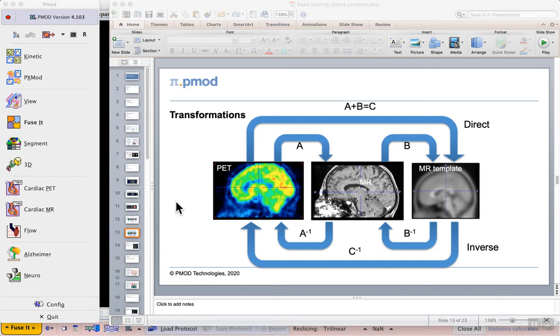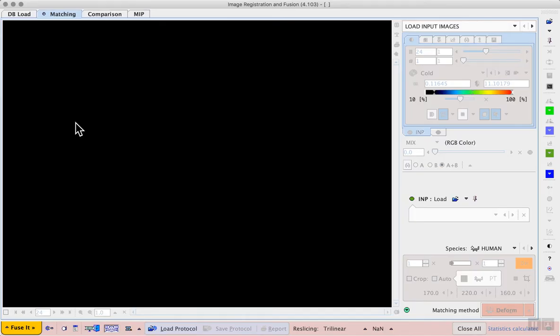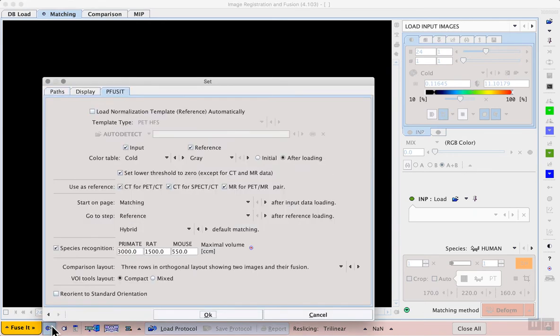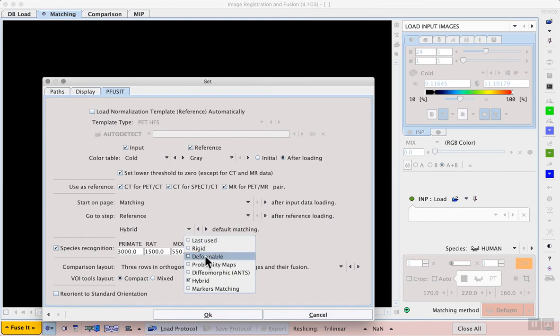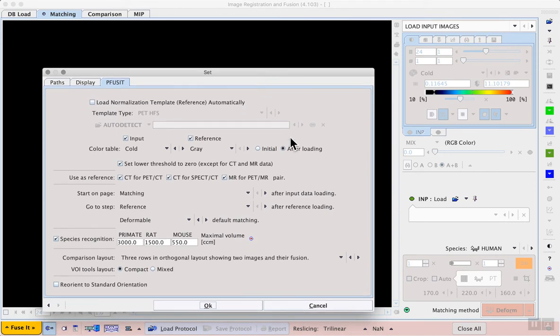The exercise will take place in the fuse it tool again. Now we can change the default matching mode from either hybrid or rigid to deformable matching so again this is from the fuse it configuration that we've seen in the previous exercises.